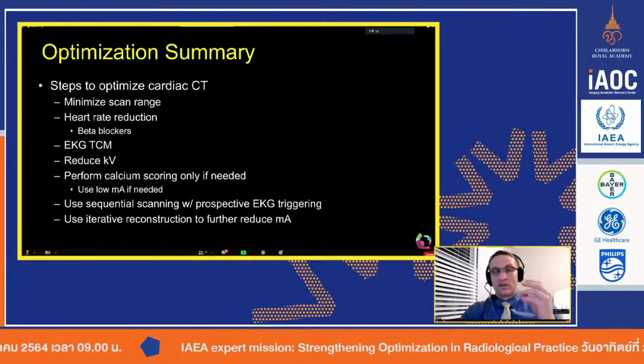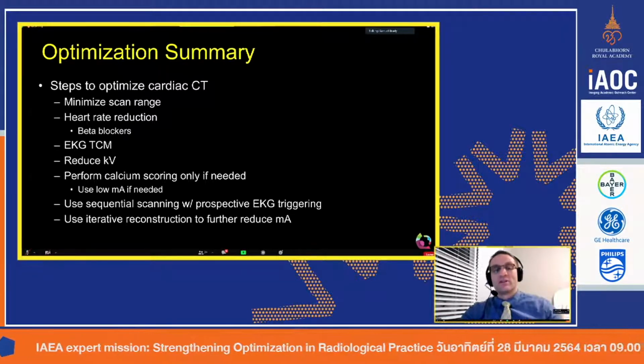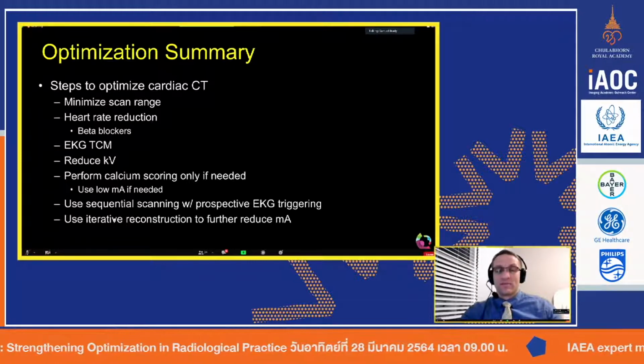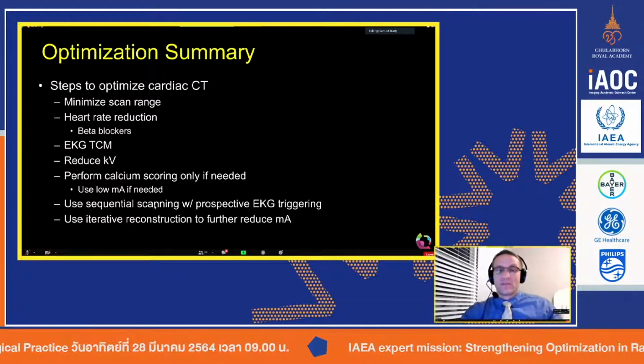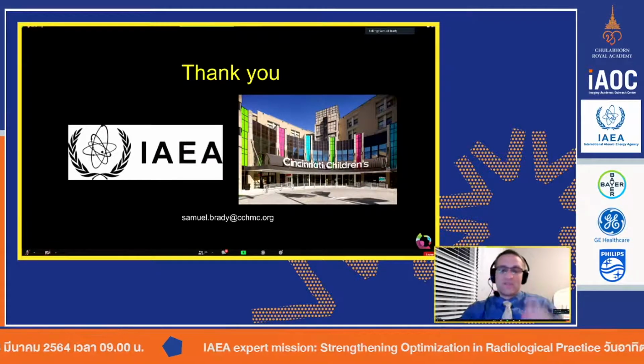That said, I will be the first to admit, when you use iterative reconstruction, it does fundamentally change the type of image, the texture, and it can soften the edges in the image. I showed you this last week. So there may even be some doctors out there that just can't look at an iteratively reconstructed image of the heart and feel that it's appropriate, because it softened the image a little too much.